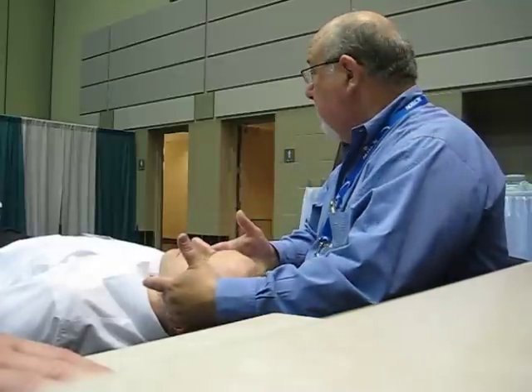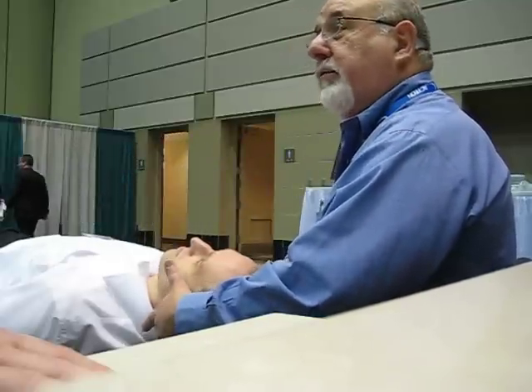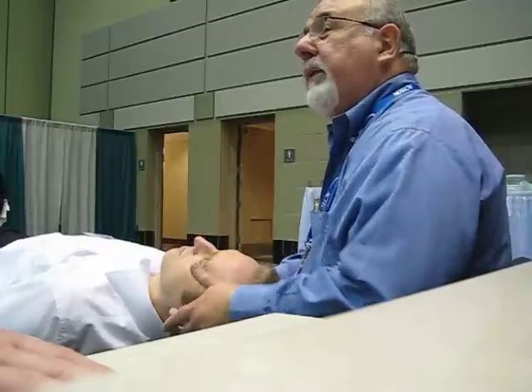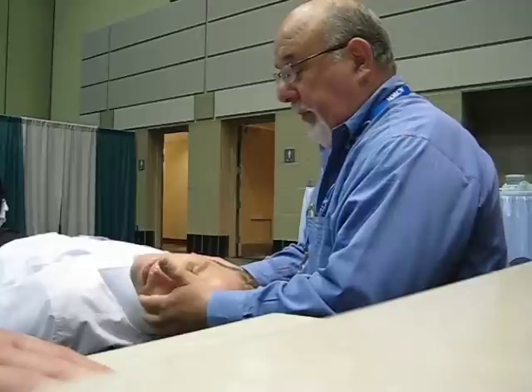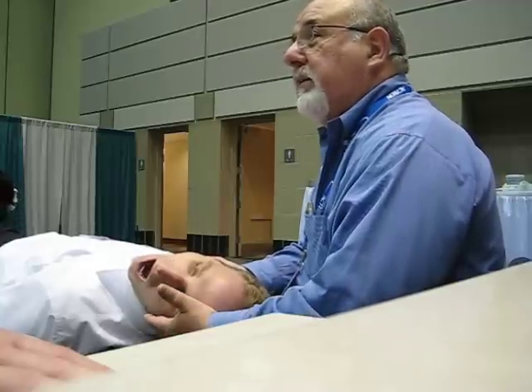What we're attempting to do here is to keep the occlusal surface perpendicular. Now if I want to articulate, all I do is I put 2 fingers under the occipital here, rest it on here, and they stay right there. I don't even have to worry about it. The other thing is when we're positioned like this, I could open, can you see your view now? They can't see like that if you're not into this position.